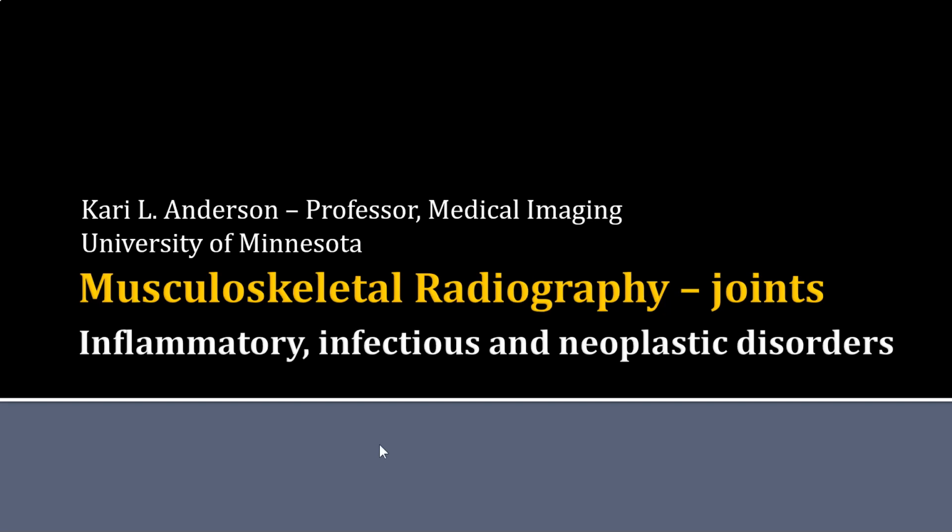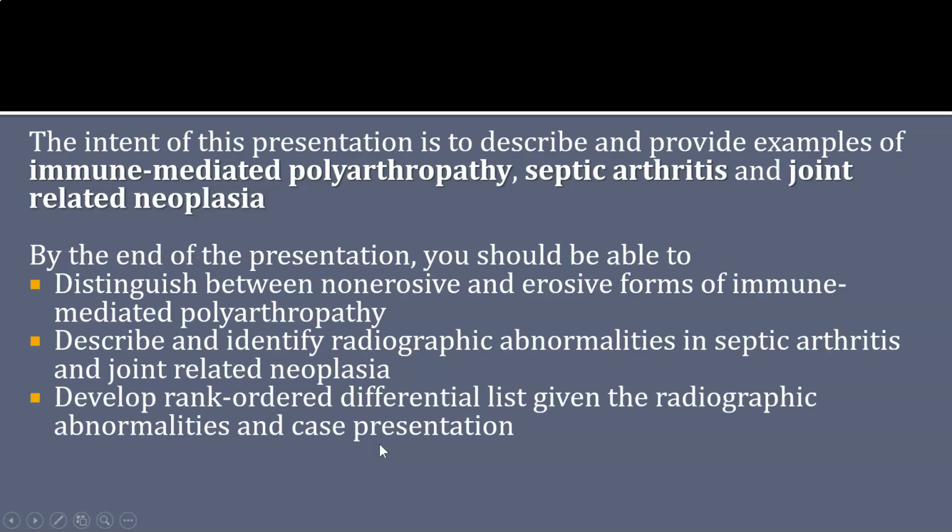This is the 9th in a series of presentations on radiography of joint disorders in veterinary patients. This presentation discusses a few remaining miscellaneous but important disorders you might encounter in your practice. In this presentation, we'll describe and provide examples of immune-mediated polyarthropathy, septic arthritis, and joint-related neoplasia.